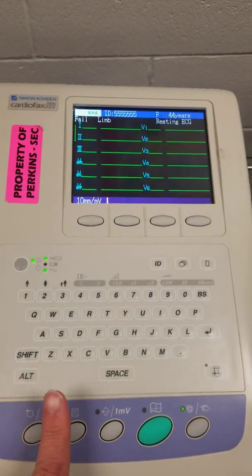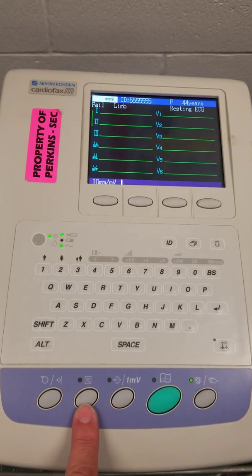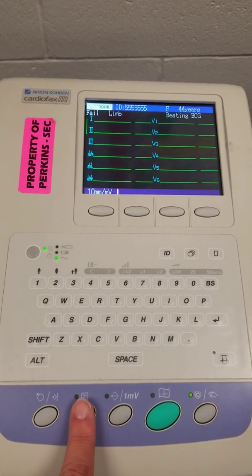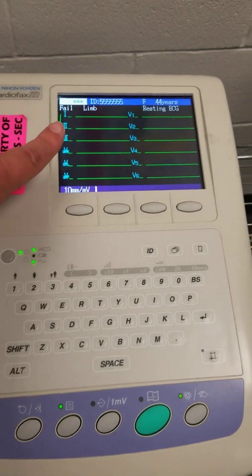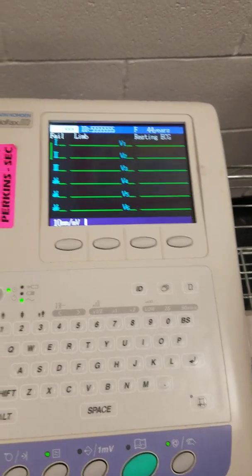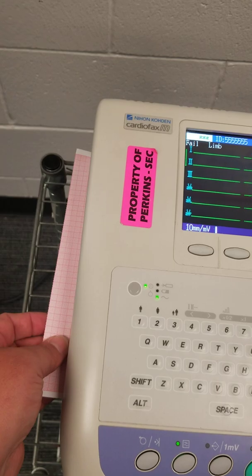When you go to print it, you're going to hit this button first — this is the filter button. This filter button allows us to get rid of any of the artifact. It will not correct what I see on the screen here, but it will correct what prints out.